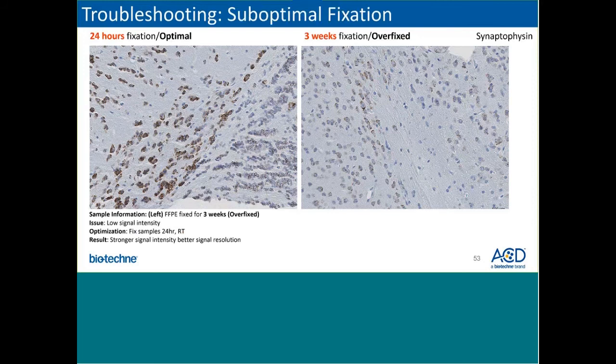When looking at tissue fixation, again, to the left is our optimal condition for fixation with 24 hours, compared to the right panel, which is FFPE tissue that had been fixed for 3 weeks. So as you can compare with the staining, the signal is much lower in the overfixed sample. And so to optimize this, we would suggest to try and fix these samples within our recommendations.